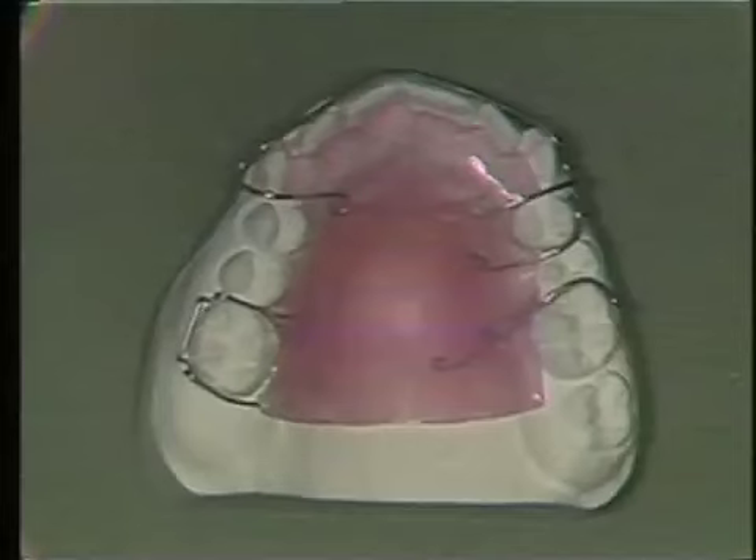The acrylic removable appliance is one of the most useful clinical tools in orthodontics. It may be used as a retainer to hold teeth in a corrected position after orthodontic treatment, or it may be used to perform minor tooth movement through the use of auxiliary springs. Also, upper arch removable appliances may serve as bite planes to control the vertical alveolar growth displacement of teeth.